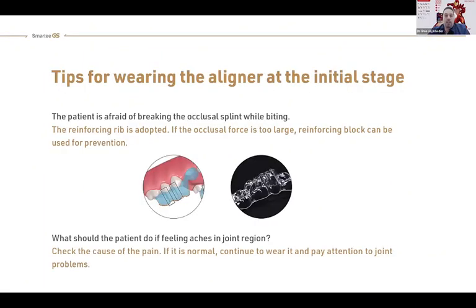If we are afraid, for example, that the patient will break the aligners while biting, we usually ask the patient to chew light things, like noodles, for example, soft eating. The focus is not on chewing the food itself, but rather on making the muscles and the condyle adapt.